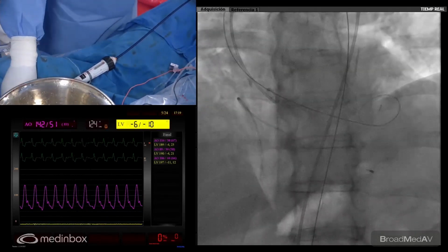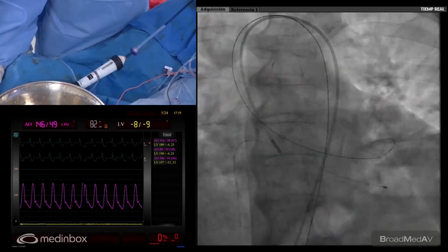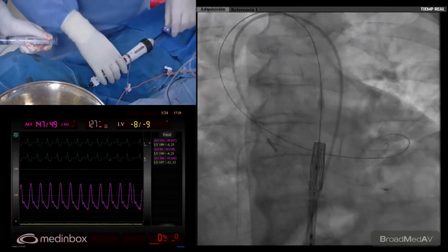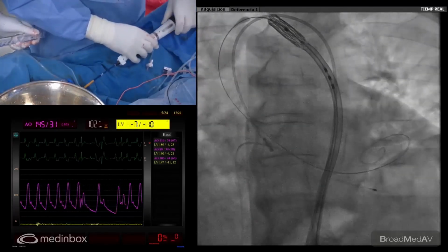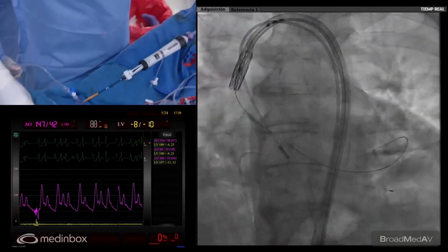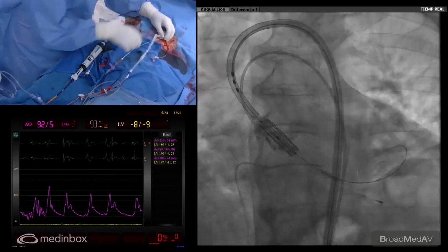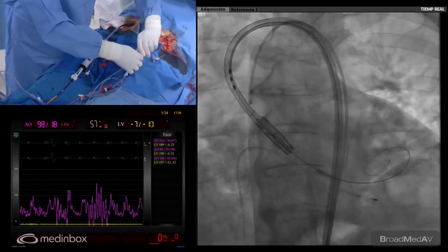Okay, let's go to the working projection. Let me hold the wire myself. It's okay. Do I have to withdraw? Yeah. The patient is too long, so we are going to deflect the catheter for the aortic arch. We can zoom a little bit now. And we are almost in. Okay. We can wait there. We can reposition the pigtail, which I think is twisted with the valve. And I will need the Amplatz wire to go into the sinus.